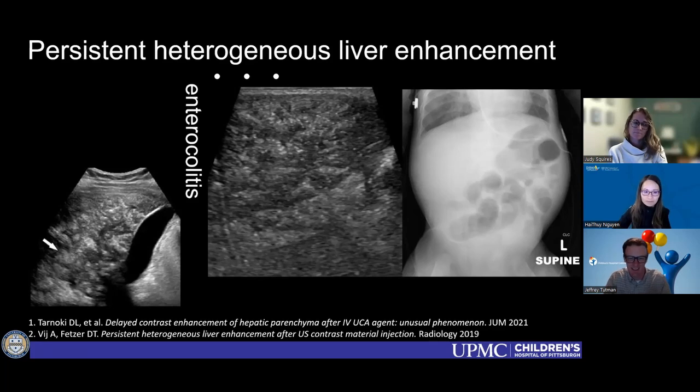I have not seen that. That's definitely a good thing to be aware of, though. Yeah, you didn't mess up. It's just one of those things that can happen.